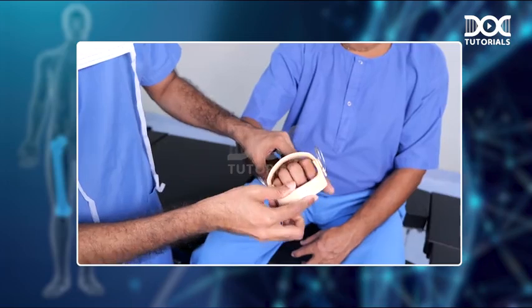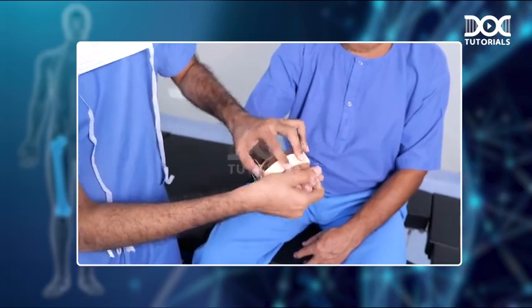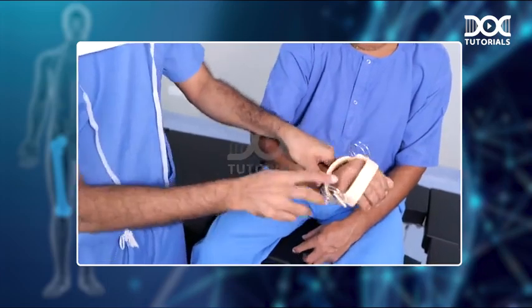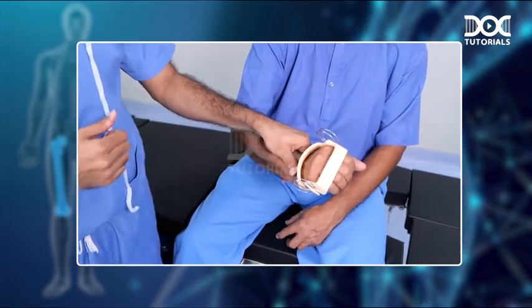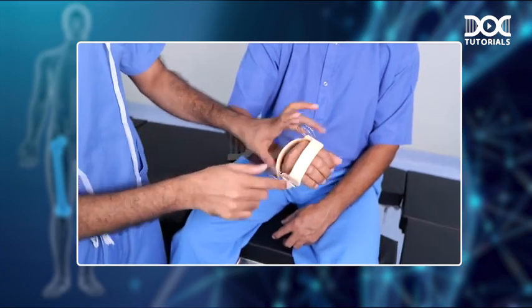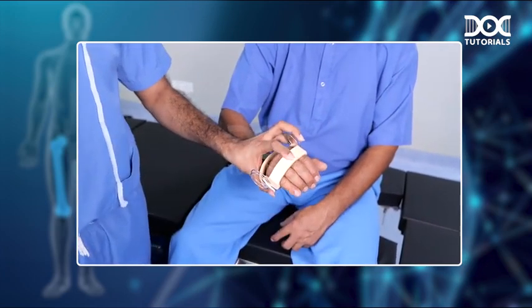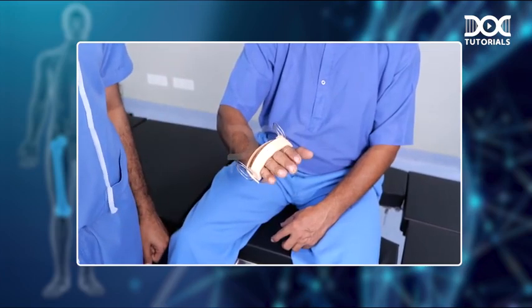So here I am applying the knuckle bender splint. Whenever I am applying it, I put it as far inside as possible, and you can see that now the knuckles are in flexion. Knuckles are nothing but your metacarpophalangeal joints, which used to be in extension and are now in flexion. Once the MCP joints are flexed, you will see that the patient can even extend the fingers at the IP joints. So this is the function of your knuckle bender splint.